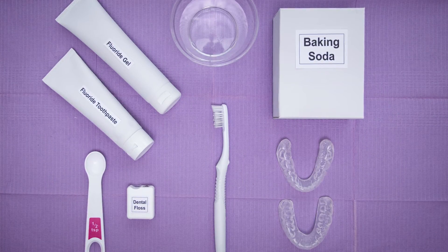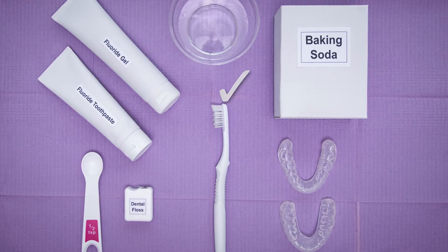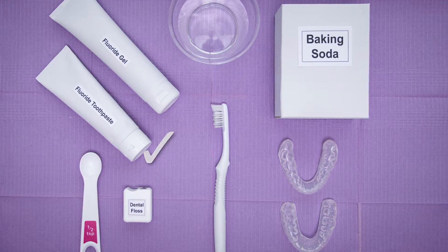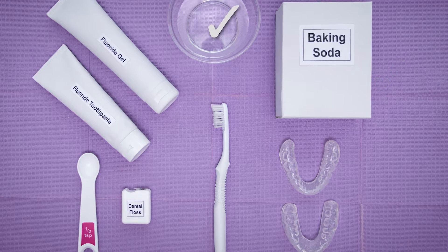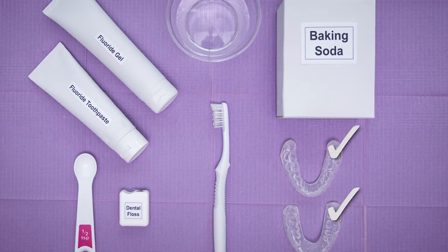To apply fluoride with the tray, you will need fluoride, dental floss, a soft bristled toothbrush, fluoride toothpaste, baking soda, a cup of room temperature water, fluoride gel, and fluoride trays.